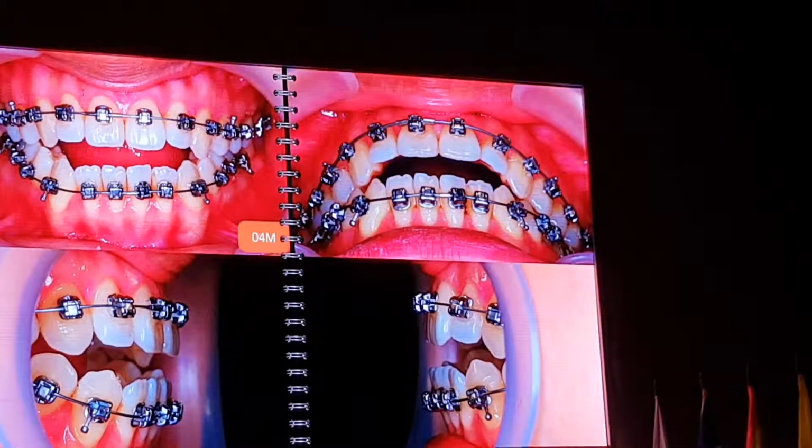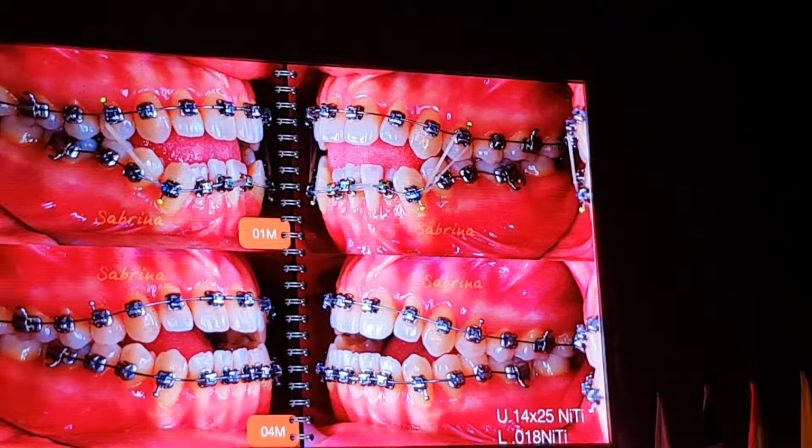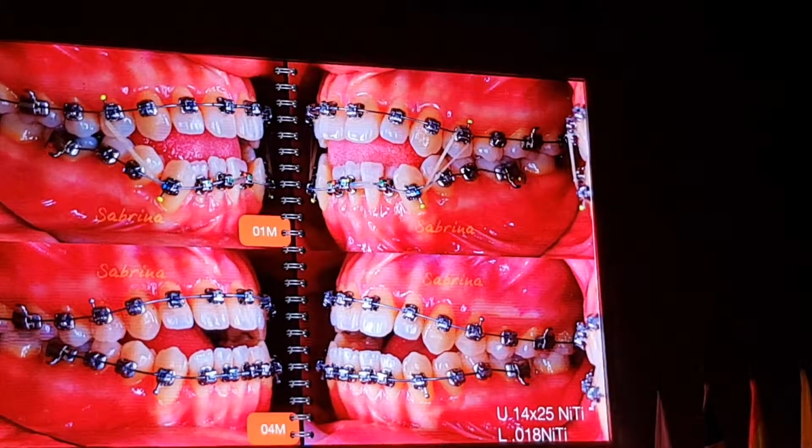So now it's 4 months in progress. You can see the uprighting of buccal segment come here.